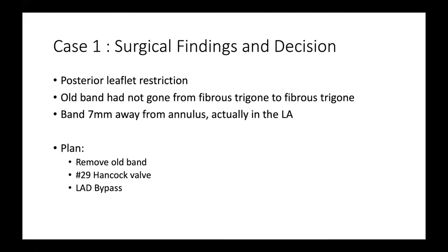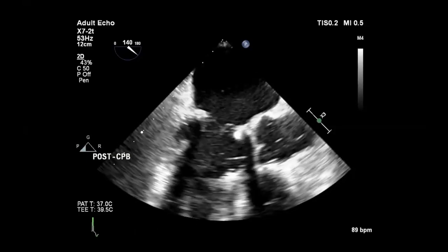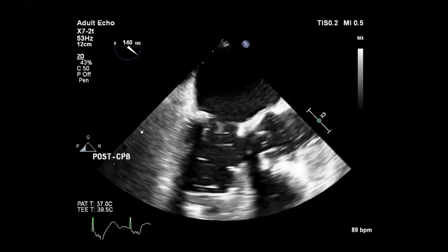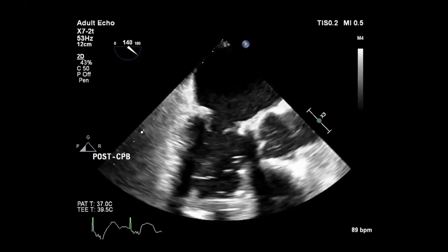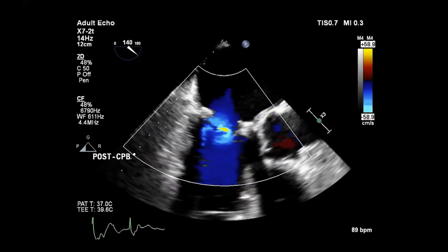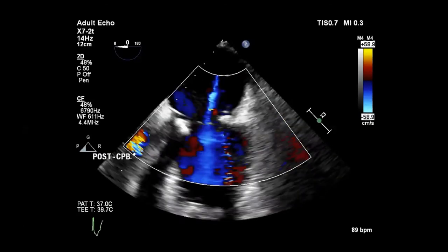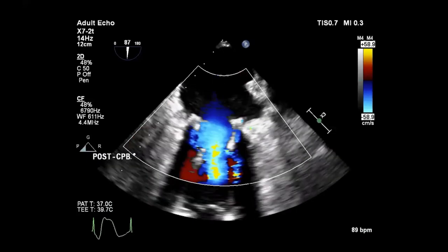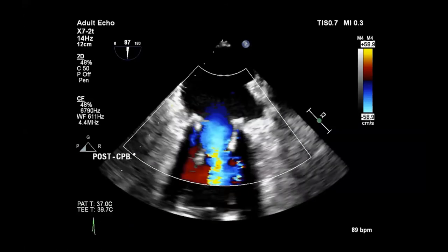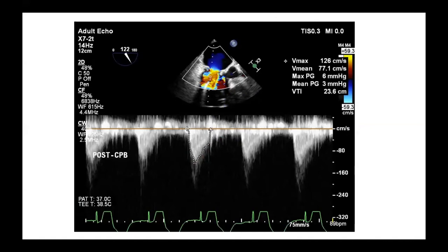What did the surgeons find? The posterior leaflet was restricted when they went in. The old band had not gone from fibrous trigone to fibrous trigone — in fact, the band was seven millimeters away from the annulus, actually in the left atrium. The plan was to remove the old band, put in a 29 size Hancock valve, and do an LAD bypass. These are the post-bypass images. The valve is in place, there's a little air just coming off pump, leaflets seem to be opening well, and there's no residual MR. The LV function doesn't look as good, but that's normal coming off pump initially after one of these operations.